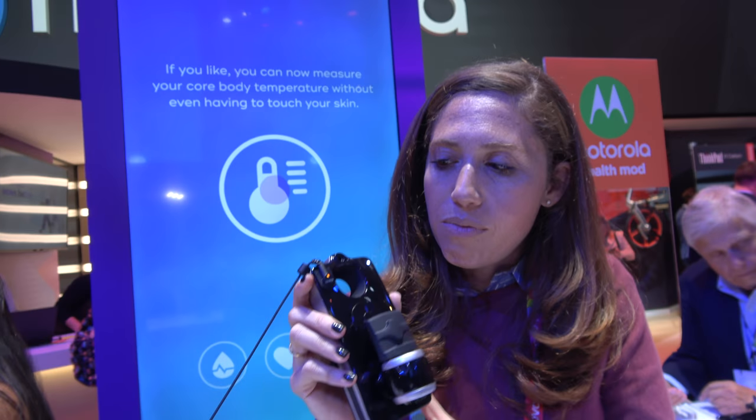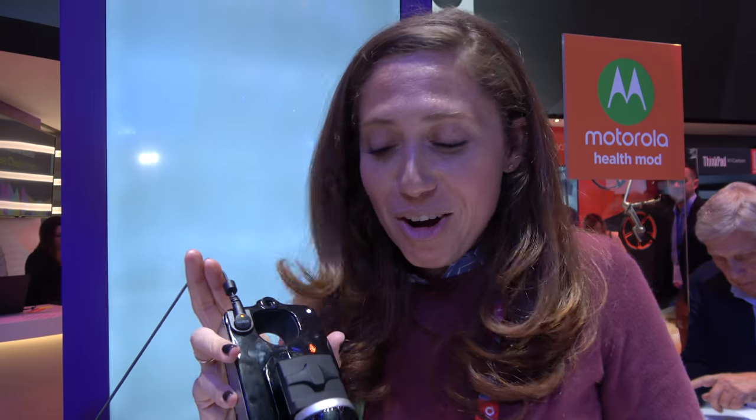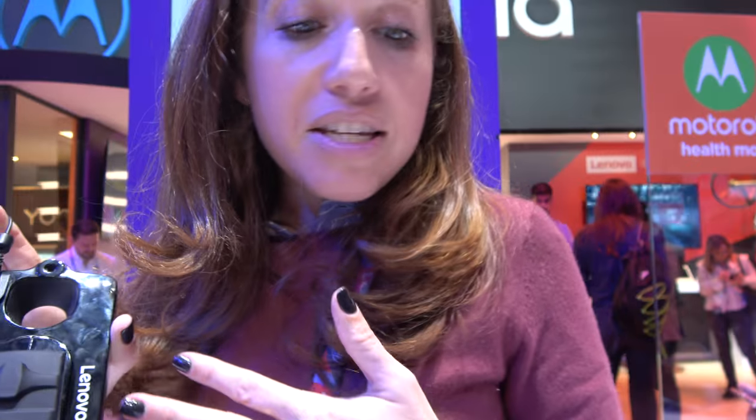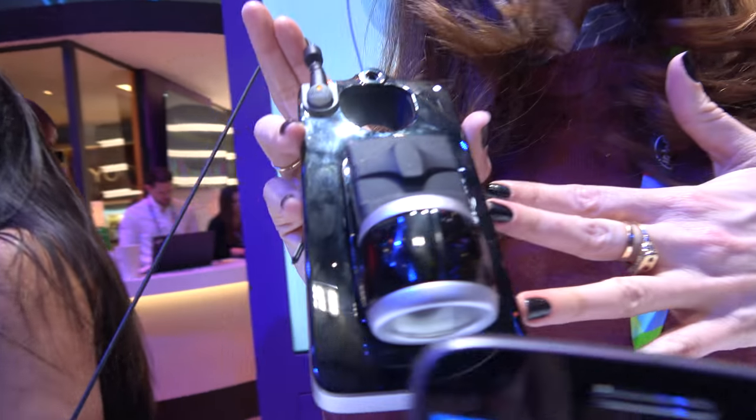Right here we are checking out the new Moto Mod. I'm Liz Gross, the chief marketing officer of Vital USA Inc. We are the manufacturer of this new Moto Mod — the Moto Health Mod.